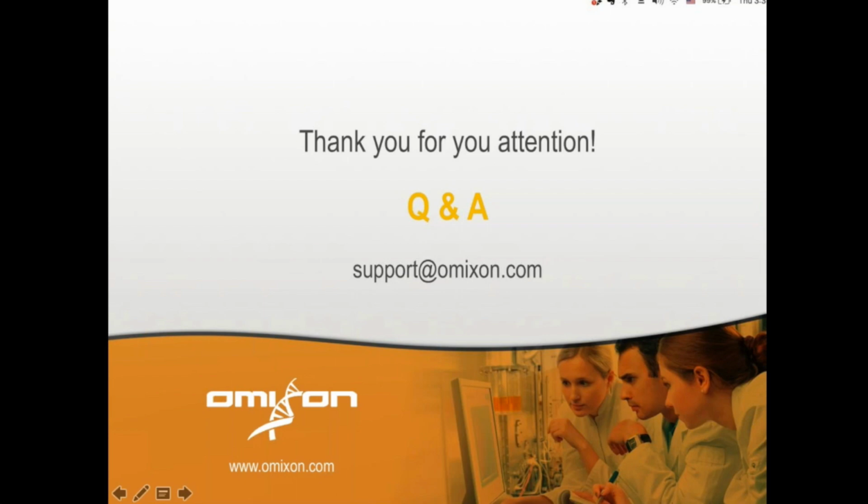Thank you, Libor. I guess we should address one last question that just came in as well. I'm interested in trying the Monotype ABO. What do I need to do for that? All you have to do is just contact your sales representative, or email us at sales@omixon.com, and we will provide everything that you need for that. Thanks for your interest.